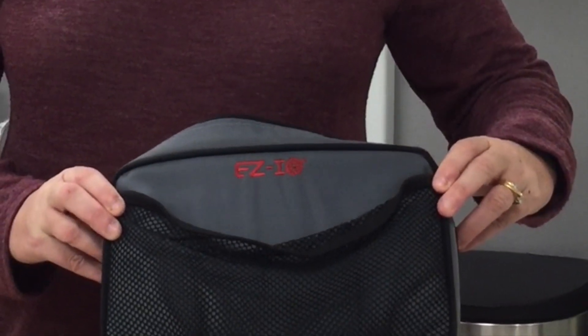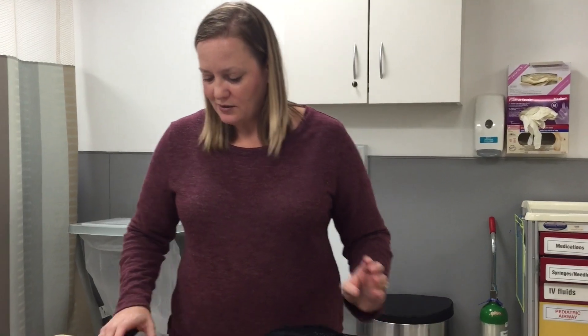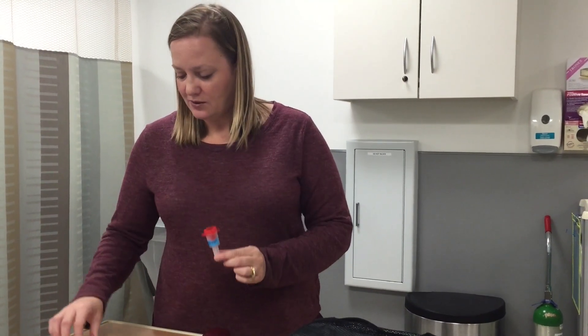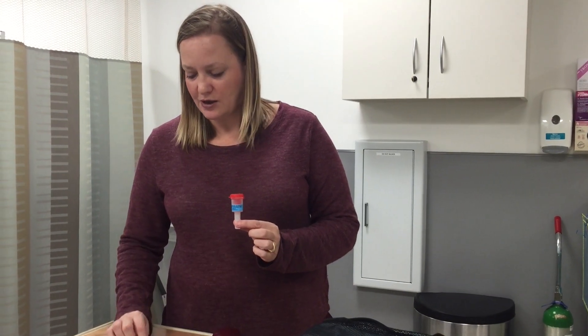In our emergency department, we have the EZ-IO kit. When you open the kit, it will have a drill, it will have a needle, and the equipment to attach your line to an IV.